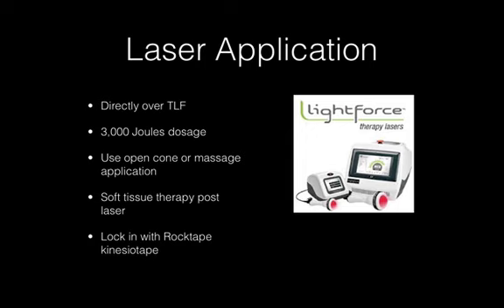So the laser comes directly out of a special optical ball so that you can deliver myofascial soft tissue release or trigger point release at the same time that you're doing the laser application. And if you don't have that, you can do open cone, and then you go in later and follow that up with some soft tissue therapy right after laser. Maybe you want to do some instrument assisted adjusting, stuff like that. So Graston tools, ART, whatever you think is applicable to your paradigm, it works great.